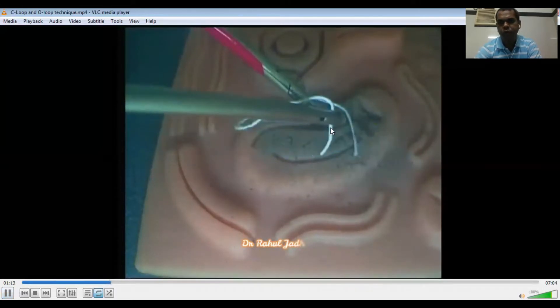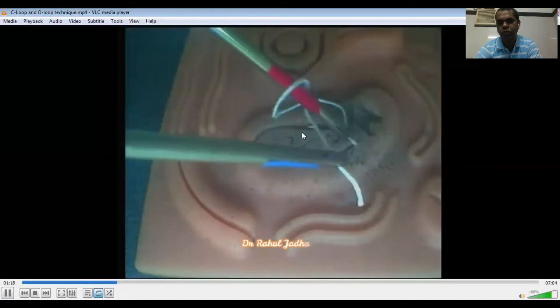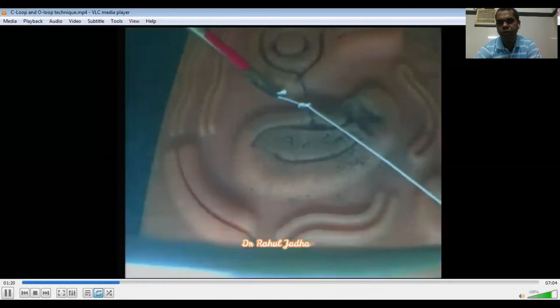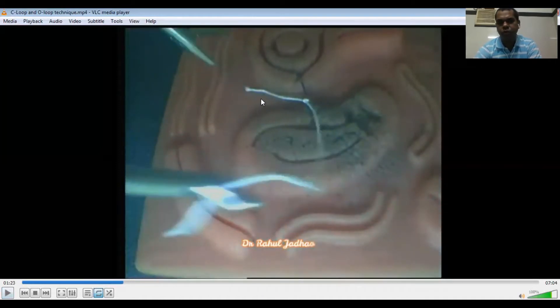Again, this is the supination of the right needle holder. Now the left needle holder will pass through this loop. Now the short tail and long tail are pulled.